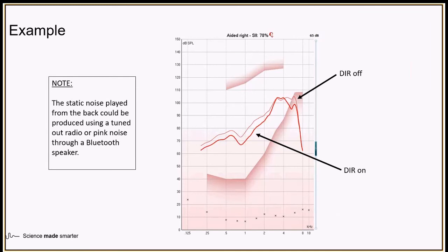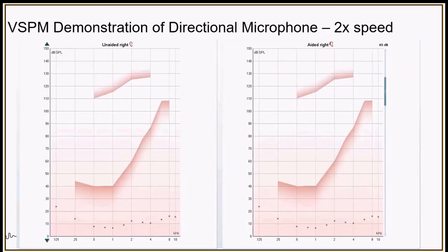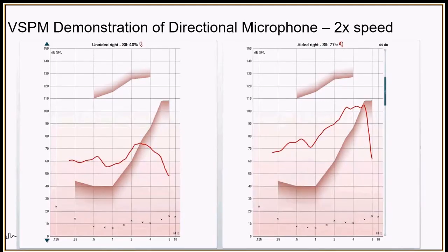Good. As before, I have a video again. Again, it's sped up because these features take a little bit of time to recognize the incoming signal to then decide how it should process. So let's just play that now. First of all, we see the signal coming in, and then we start to see the second measurement, which we've applied the feature to, and then we see a reduction in the input, as we can see here.